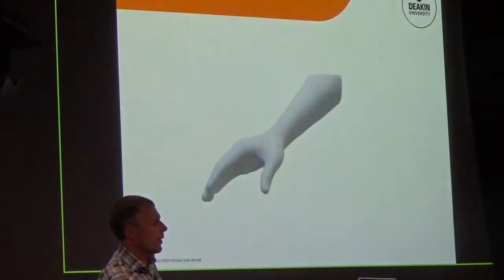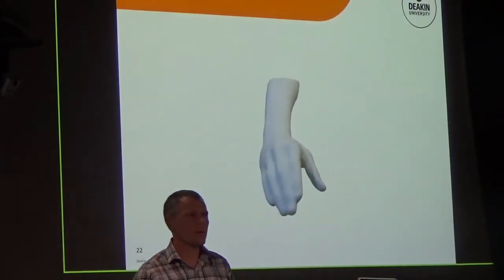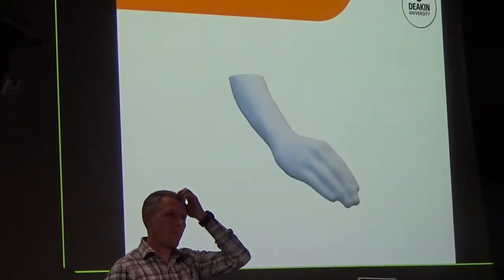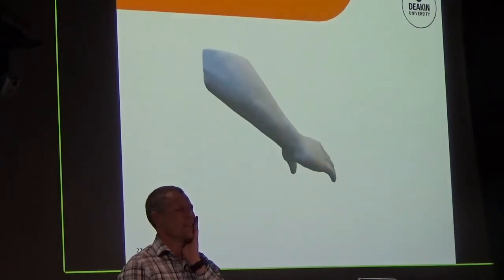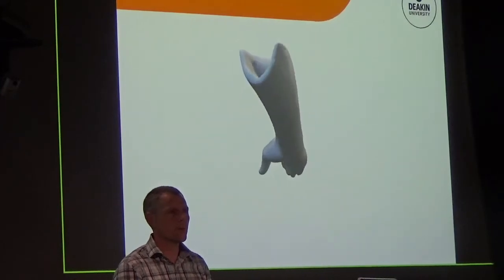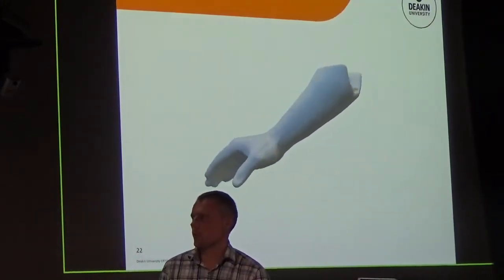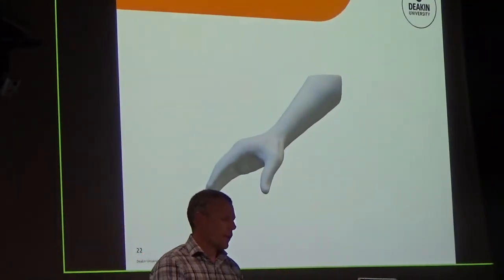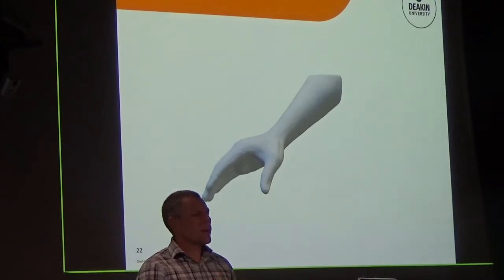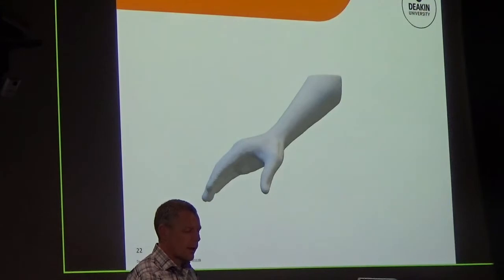So from that, this is then what you can get. Okay, so this is the image, a 3D image of the limb, and with that at a pretty good detail for what we need. You don't need to go to how many hairs are on the person's arm, and the level of detail within that as a 3D image is pretty good. From this, you've then got an object that you can start modifying and playing with. So again, back to computer-aided design, Meshmixer is the type of program that I've used for this next little section.